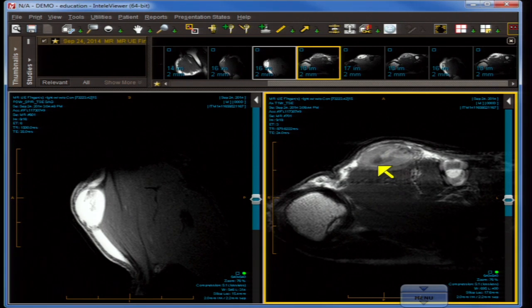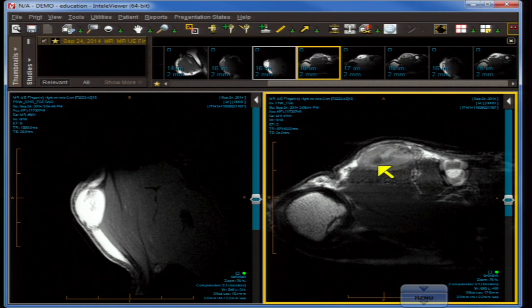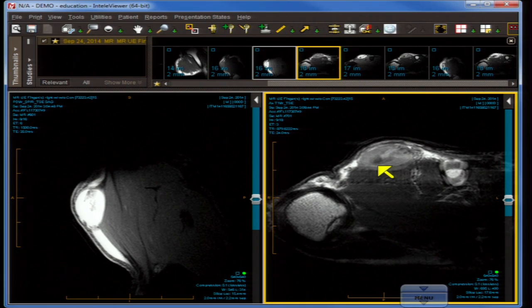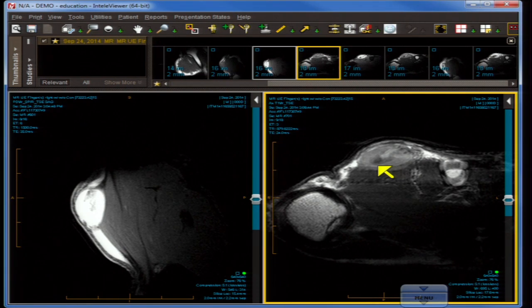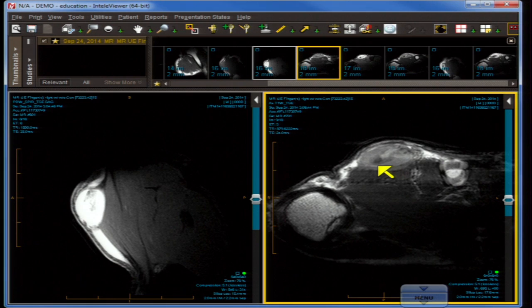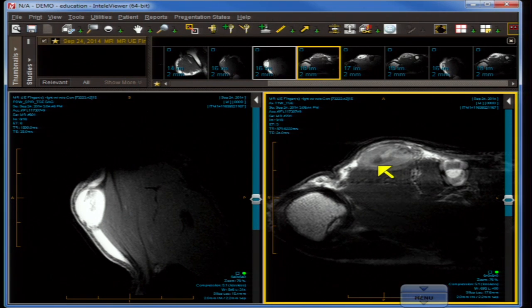Common skin lesions like the benign fibrous histiocytoma are not elliptical, not as well defined, and the signal characteristics of this common fibrous tumor don't really fit this particular case. One lesion that would fit would be a hemangioma — these can contain little bits of clot, can be round, though they're usually a bit more lobulated and irregular, frequently looking like a bowl of little raisins or small grapes. There are cavernomas that can have this appearance, although they shouldn't really present as such a beautiful oval.